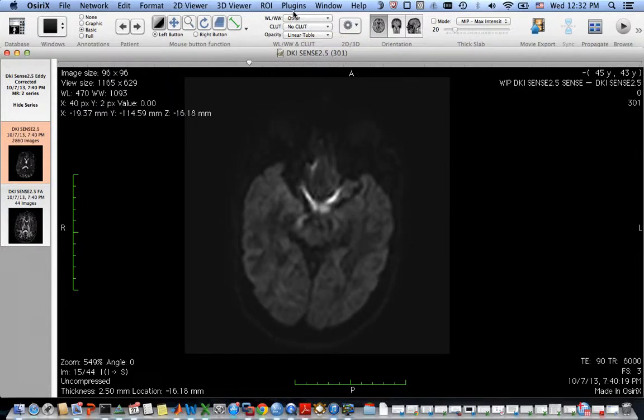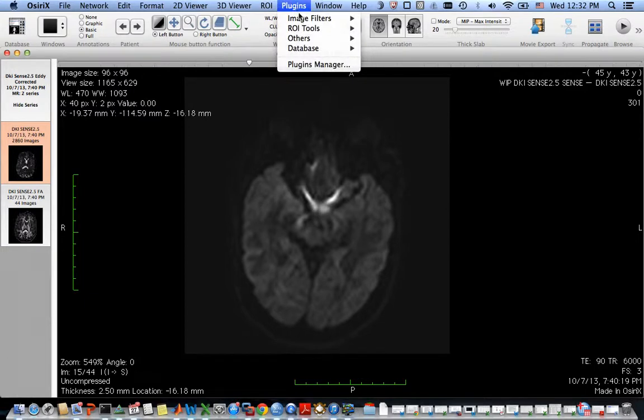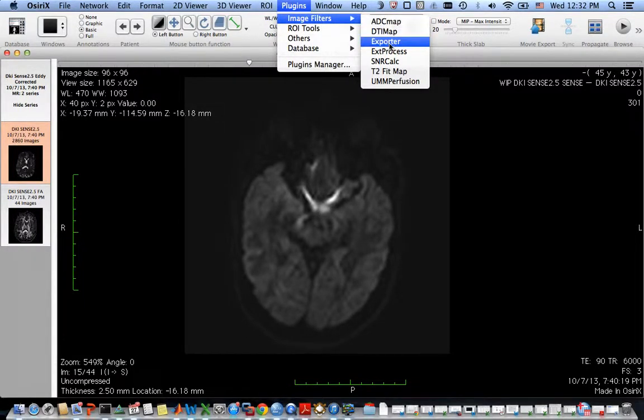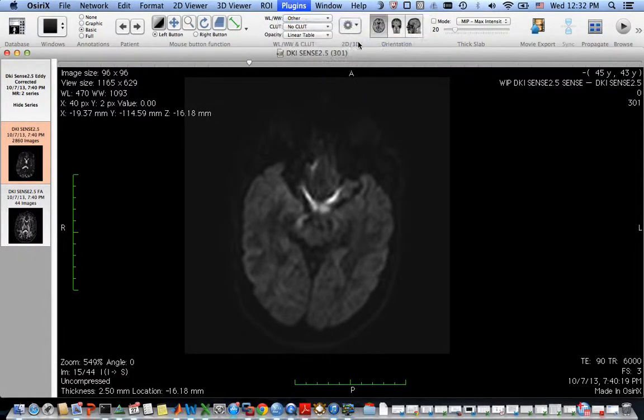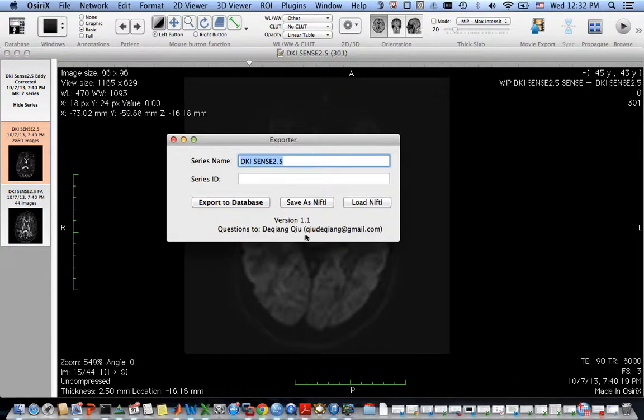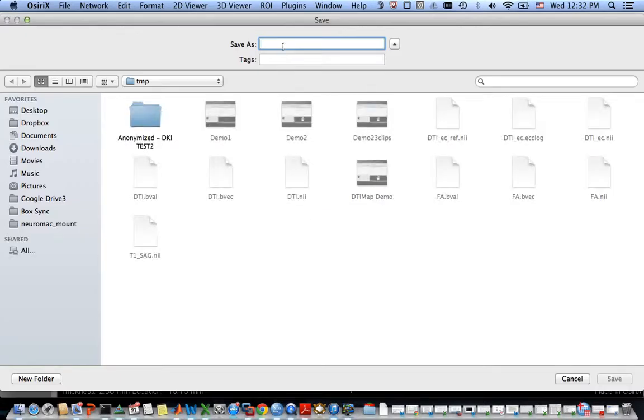You go to plugins, image filters, and exporter, and then hit save as Nifty. Give it a name, DTI.